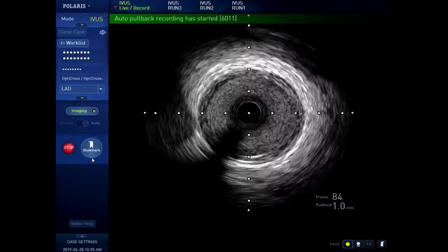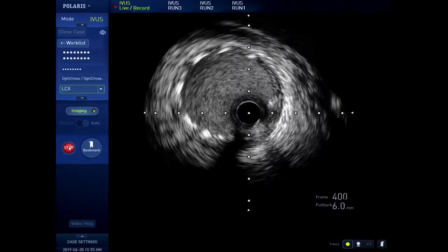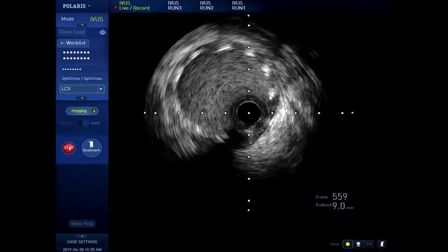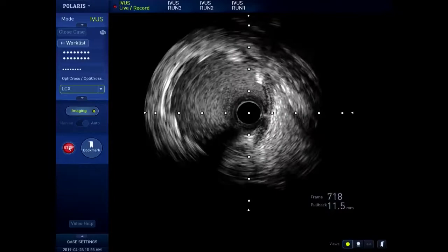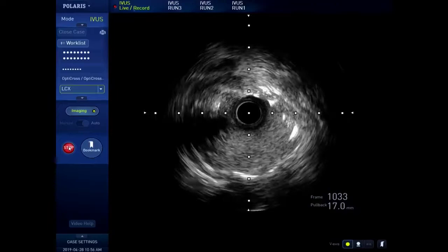This is the IVUS from the circ to the left main. We can see what's happening at the circ ostium. Very good, it's amazing how normal it is. There's also a registry from Samsung where the 10-year mortality advantage with IVUS guidance in the left main subgroup was an 80% reduction in mortality. That's unrealistic, but I think the randomized trial from China is reasonable. Okay, great.